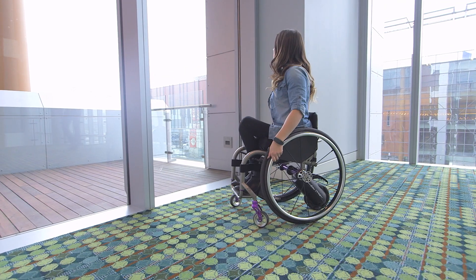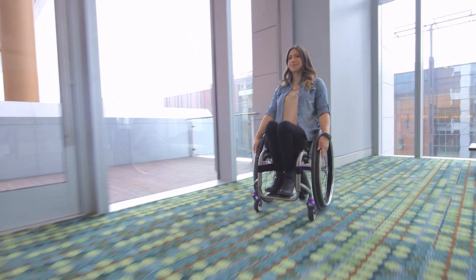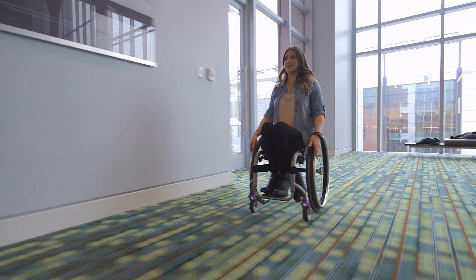The SmartDrive works like a cruise control — you set the speed with the speed of your push. Push slow to go slow, push fast to go faster.